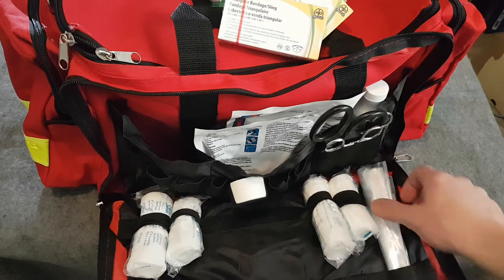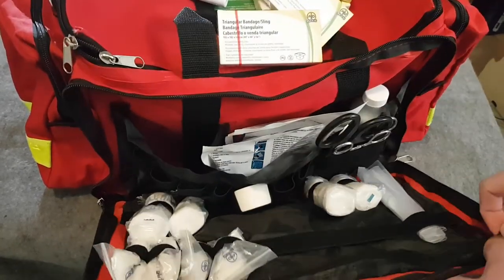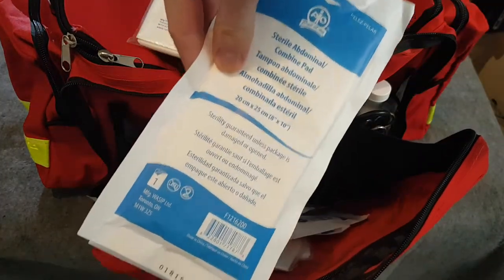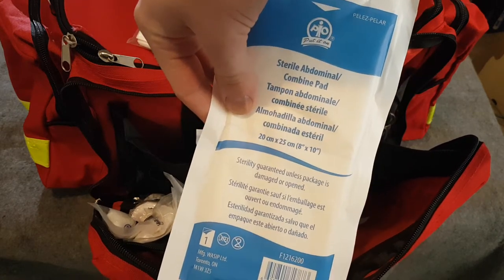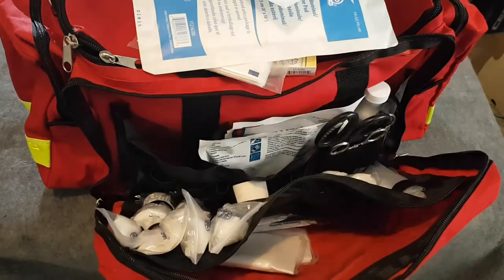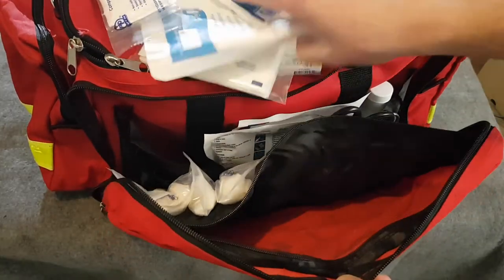It comes with assorted roller gauze, some extra plastic bags, and more gloves. In the gauze compartment we have four-by-four gauze pads, eight-by-ten combine abdominal pads, more combine abdominal pads, five-by-nines, some pressure bandages, and some compressed bandages. That's it for that compartment.